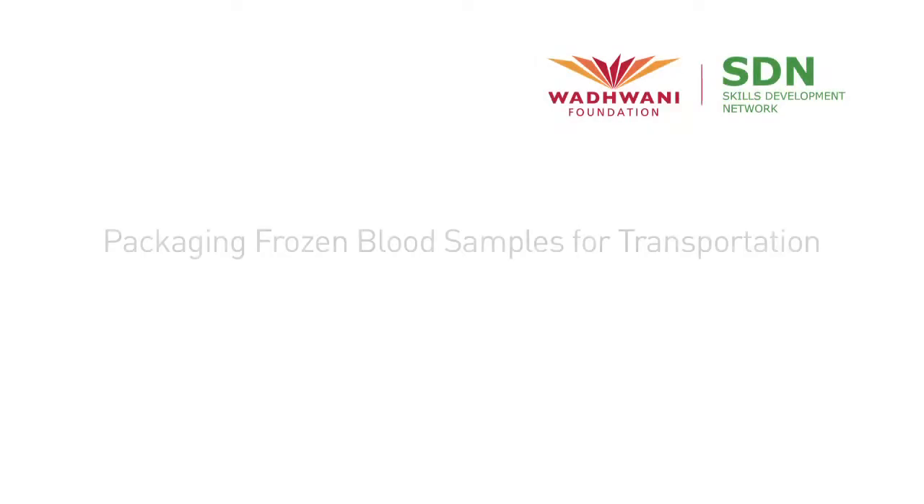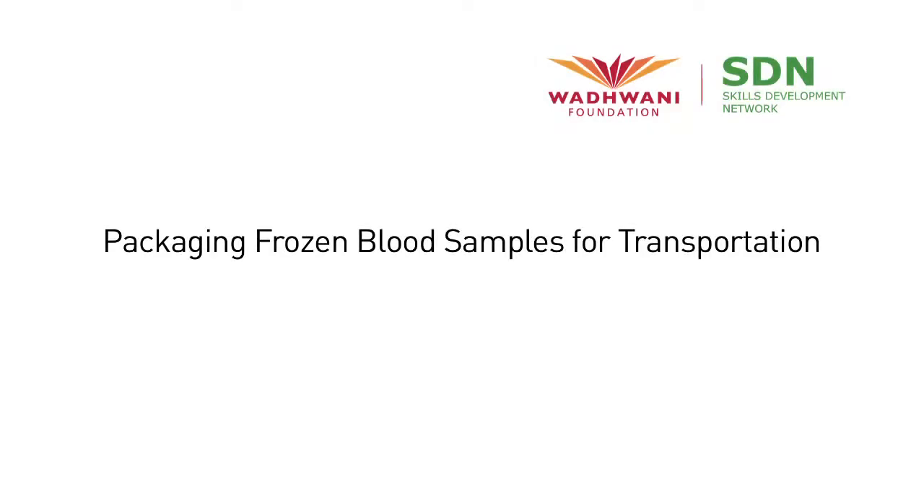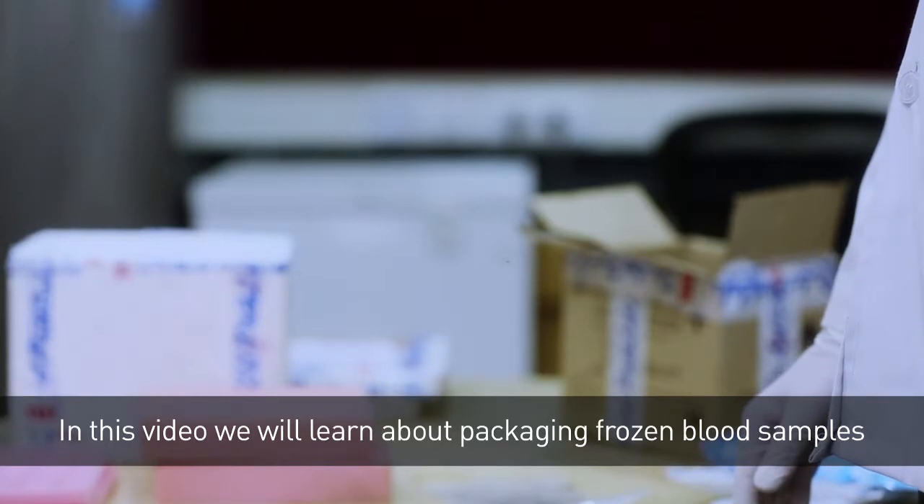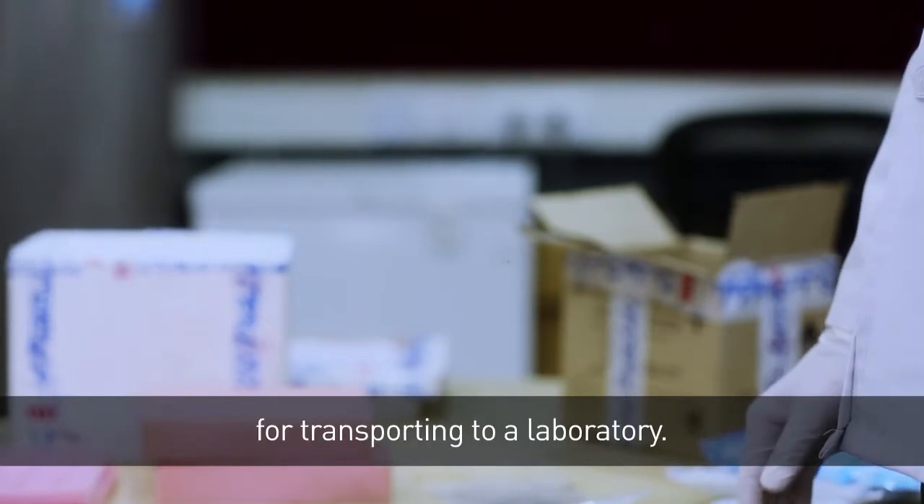Welcome to a video on packaging frozen blood samples for transporting to a laboratory. This video is brought to you by Wadhwani Foundation. In this video, we will learn about packaging frozen blood samples for transporting to a laboratory.